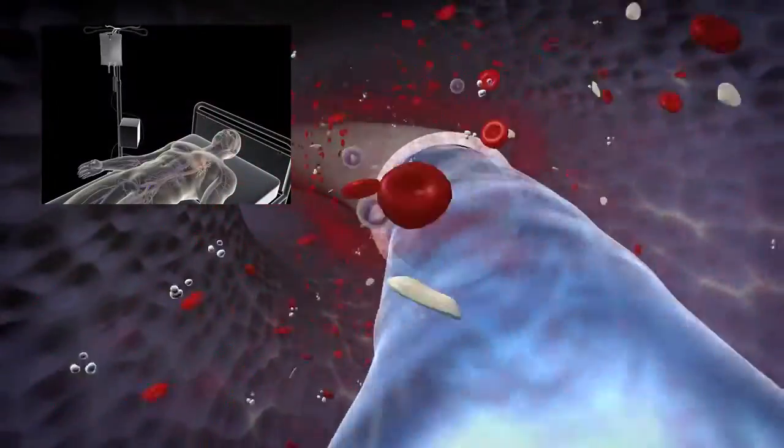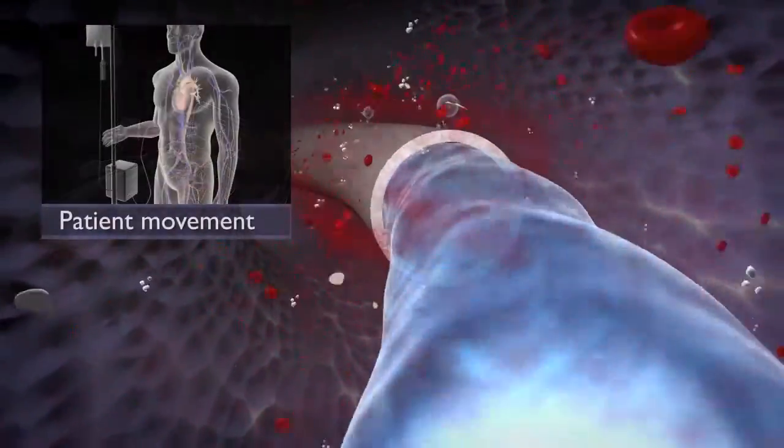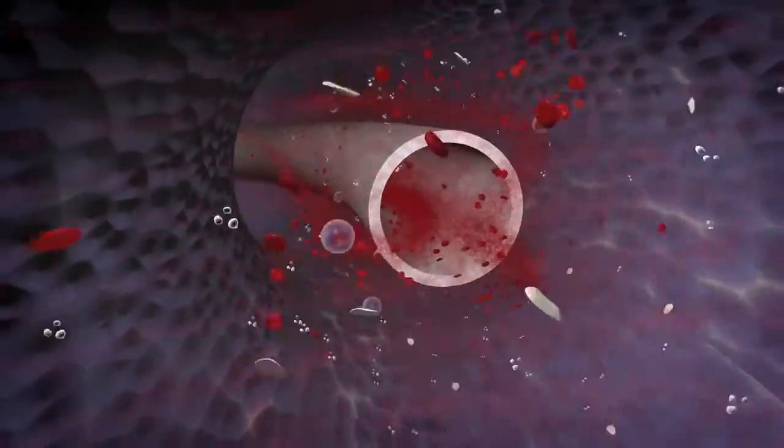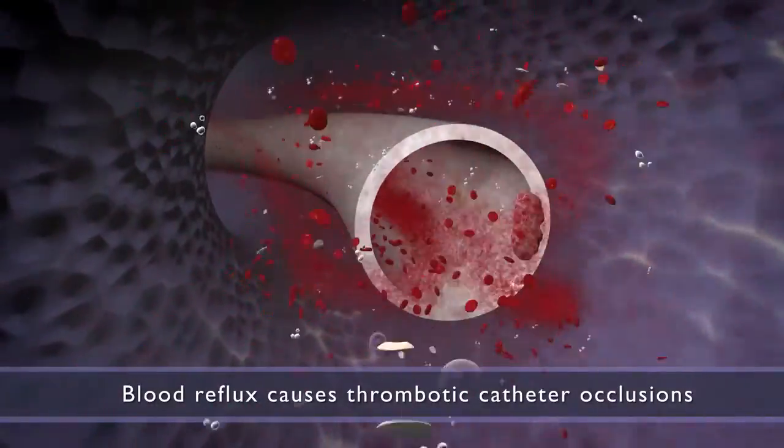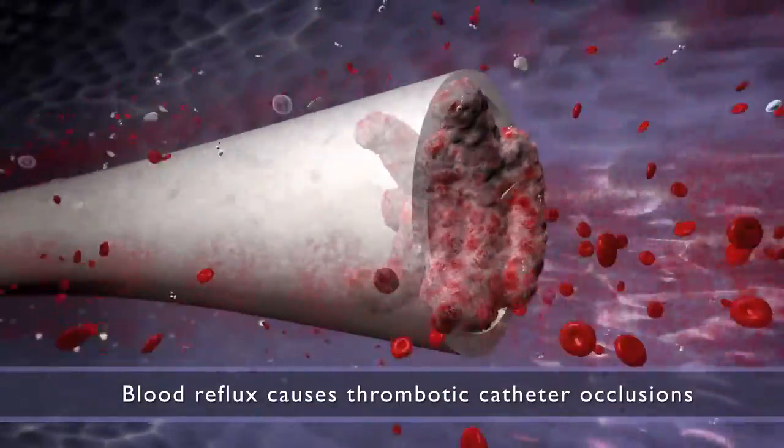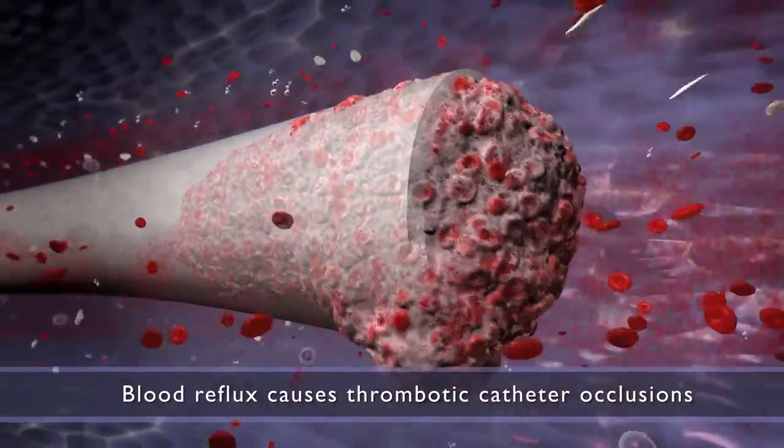Vascular pressure may increase in response to mechanical changes such as patient movement. This leads to blood reflux into the catheter. Blood reflux, or the uncontrolled backflow of blood into the catheter lumen, is a leading cause of intraluminal thrombotic catheter occlusions.